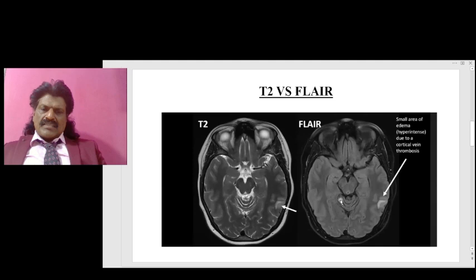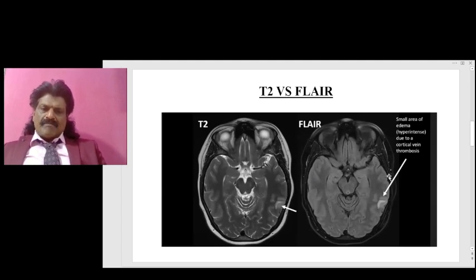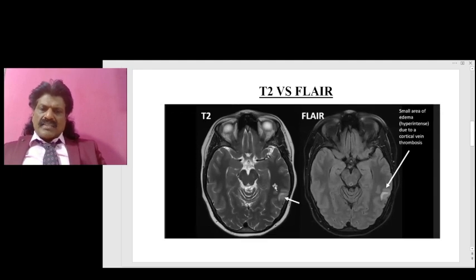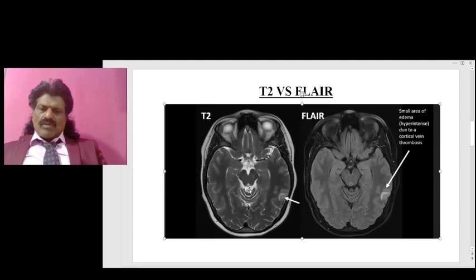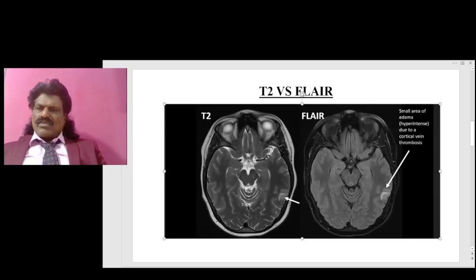On FLAIR, the CSF appears black, while the gray matter and white matter signals remain similar to T2 — gray matter appears bright and white matter appears dark. The CSF is bright on T2 but suppressed to dark on FLAIR, so lesions such as small areas of edema or hyperintensity due to cortical vein thrombosis are well visualized due to this contrast. This is the key advantage of FLAIR.